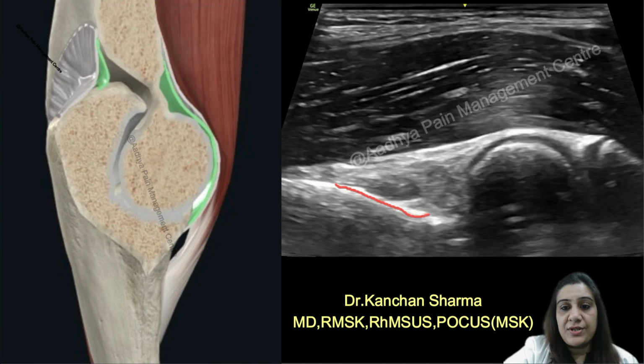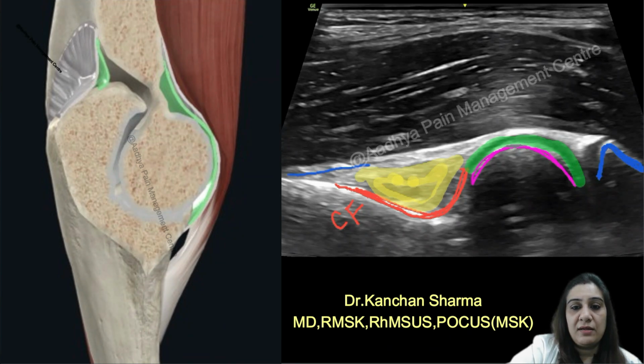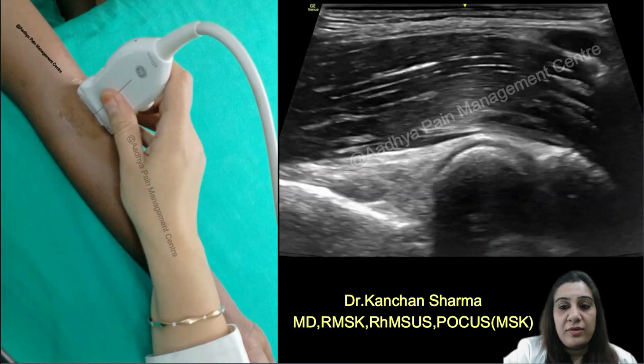So this concave shaped depression is the coronoid fossa, which is harboring the fat pads. This is the trochlea, which is having the hyaline cartilage over it. Then we have the pointed coronoid process, and what you are seeing here is the capsule of the elbow joint. This is the brachialis muscle in the longitudinal axis, and this one is your humero-ulnar joint.